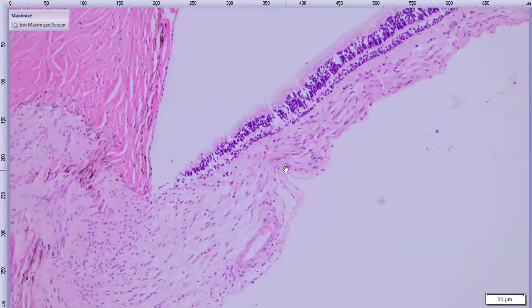And then evaluating, can you diagnose it as glaucomatous? So they say that they never really got what they would call high intraocular pressure, although maybe a little bit of uncertainty on that. And then they did say that this patient was buphthalmic, and was starting to develop, they said, optic nerve atrophy and attenuation of retinal vessels, and then also blind.